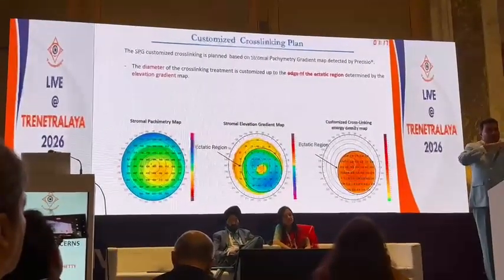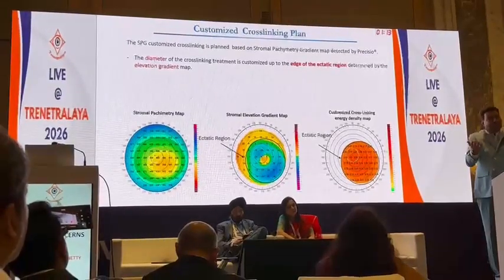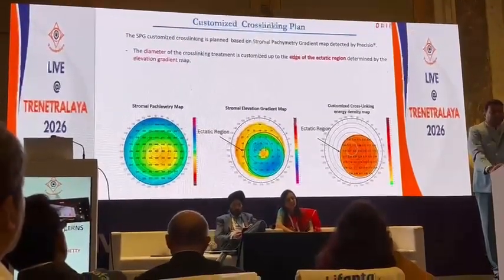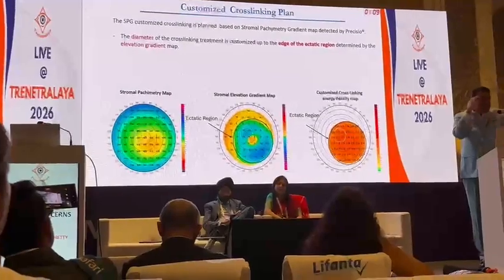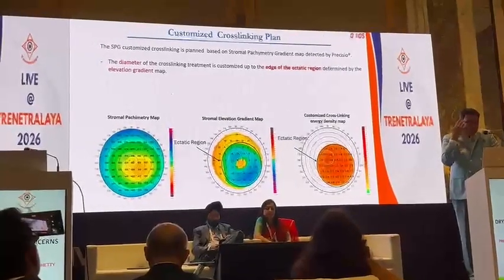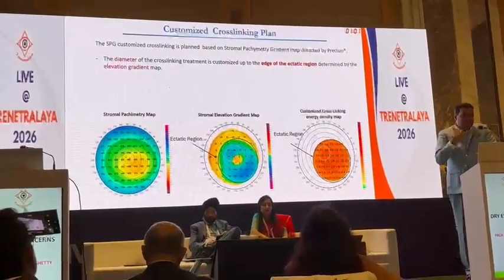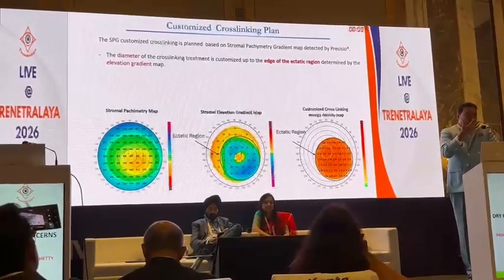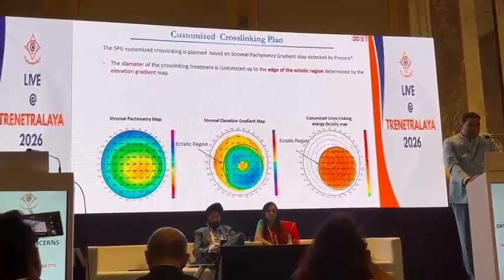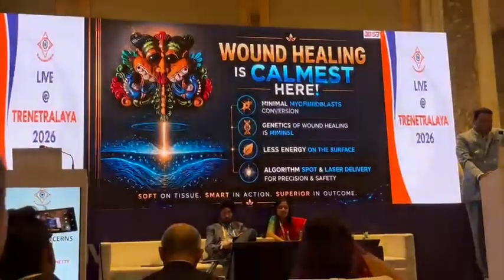So it has already taken into account, after the epithelium, the stromal thickness post-surgery, and it manipulates that. Amazingly smart thinking. It's been there for many years. The person who designed this has very complex knowledge, so for his knowledge to reach you takes a lot of time, and I think that's one of the reasons it is going slow, because there's so much intelligent planning here.